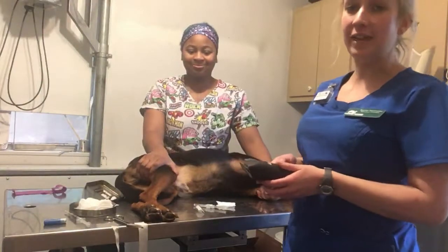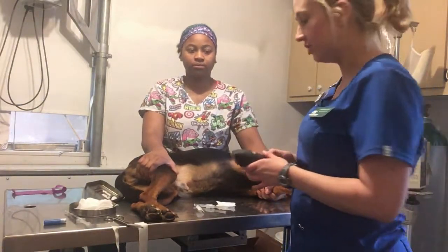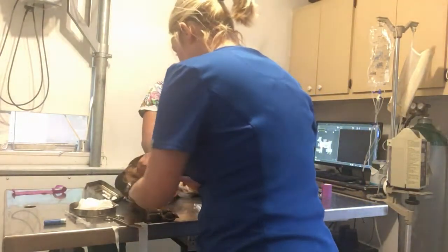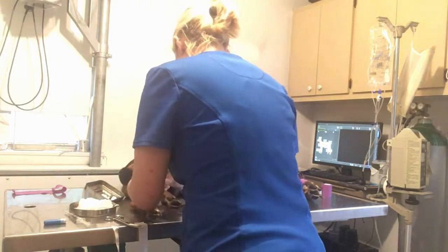I'm going to go ahead and do a saphenous intravenous catheter. The first thing you're going to do is shave the area where you're going to be putting the catheter. Okay, ready.